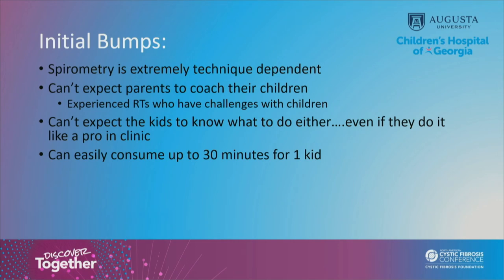And our initial bumps, as this is going to be no news for any of you probably, are that spirometry is an extremely technique-dependent maneuver, especially in children. Once the home spirometer started rolling out into patients' homes, we were like, do your home spirometry a day or so before your clinic appointment. We'll get the report. And we are using the dashboard. We definitely find that very helpful.